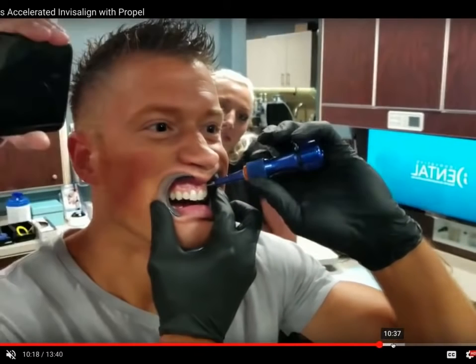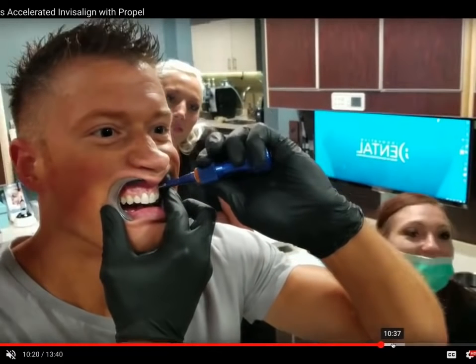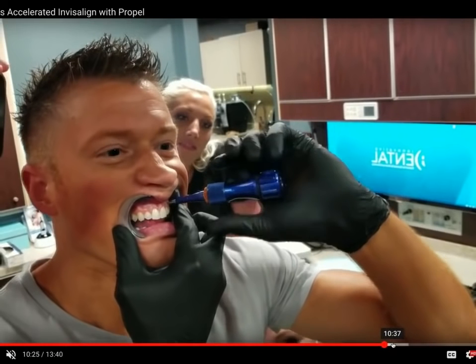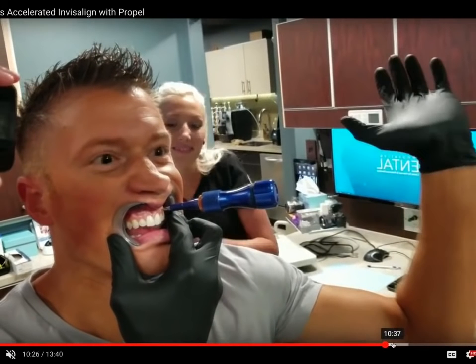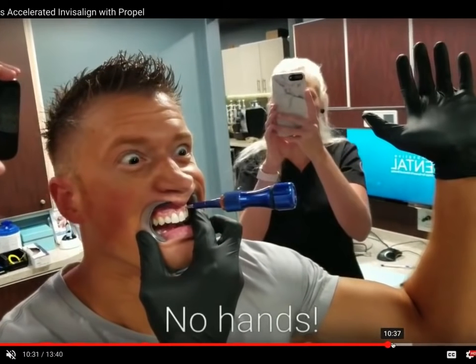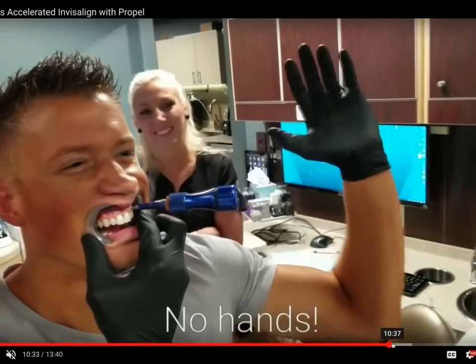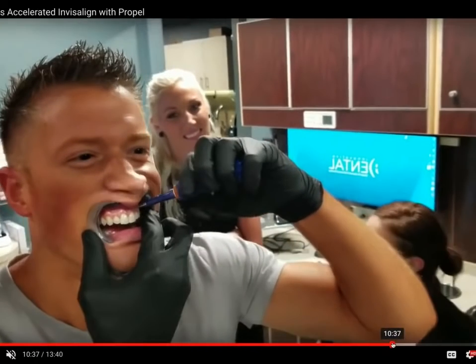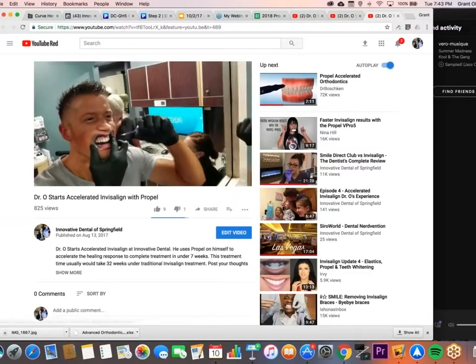It was really kind of hard to get enough force on yourself, by the way. It's a lot easier to do it on a patient than on yourself. But there you go, no hands. So the device is there in the cortical plate, worked well, and obviously causing a little bit of micro injury, but having a little bit of fun while we're doing it. So, all right, go back here.